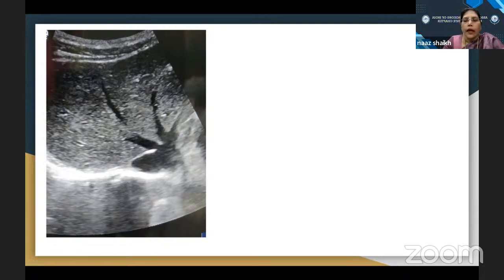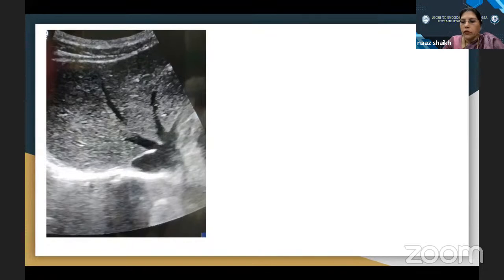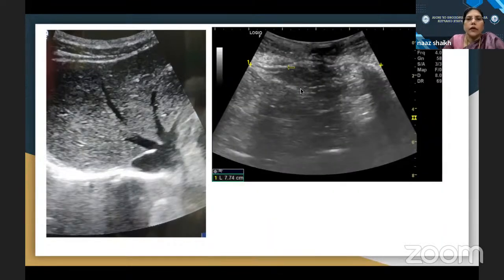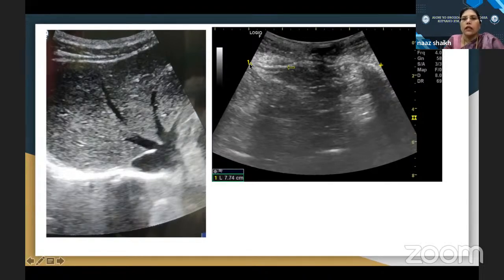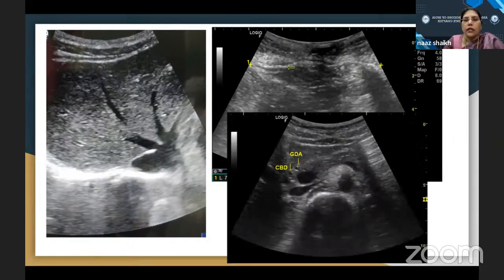Meanwhile look at the gastrophrenic angle for fluid collection, the gallbladder, right kidney, pancreas, and so many structures. Within no time you have ruled out so many things. On the left side look at the kidney and spleen. In the pelvis, even in the abdominal wall, you could see the mesh which is being placed — so you can follow up the mesh whenever this patient comes for follow-up without needing to ask the radiologist whether there is a collection underneath or if it is getting folded.